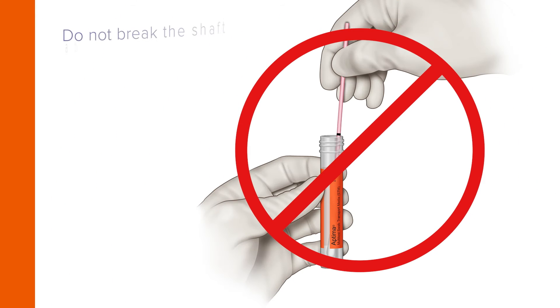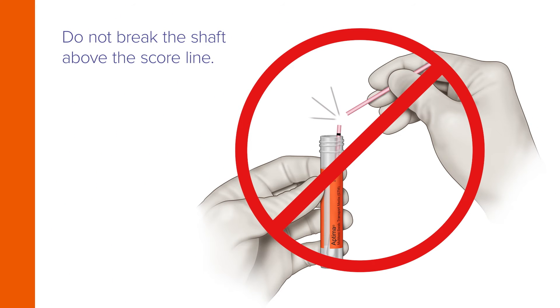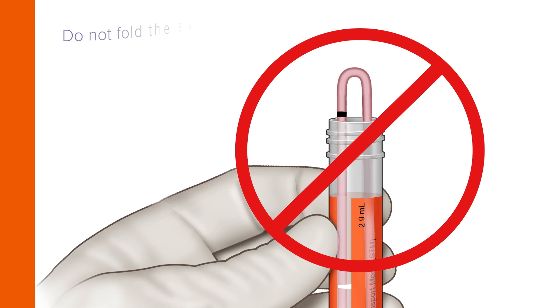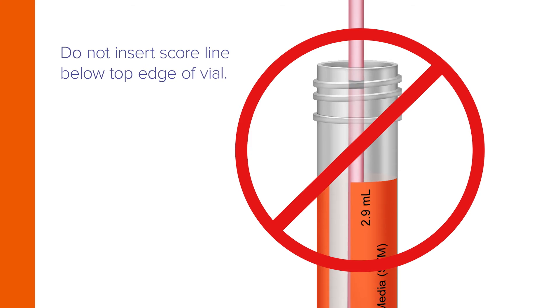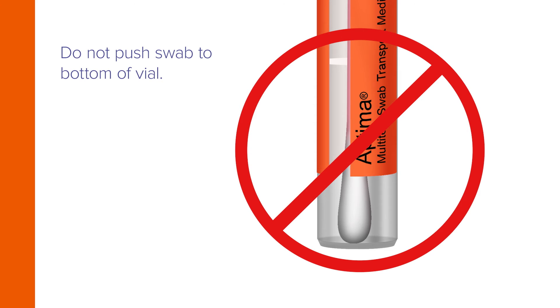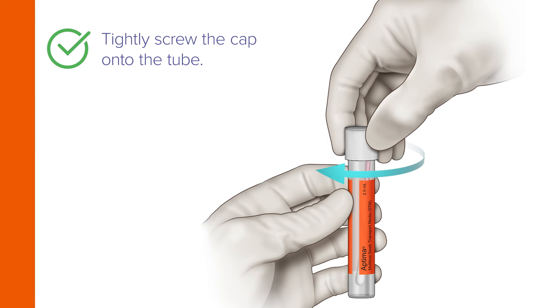Do not puncture the top of the tube. Do not break the shaft above the score line. Do not cut the swab. Do not fold the swab in half. Do not insert the score line below the top edge of the vial, and do not push the swab to the bottom of the vial. Now tightly screw the cap onto the tube.